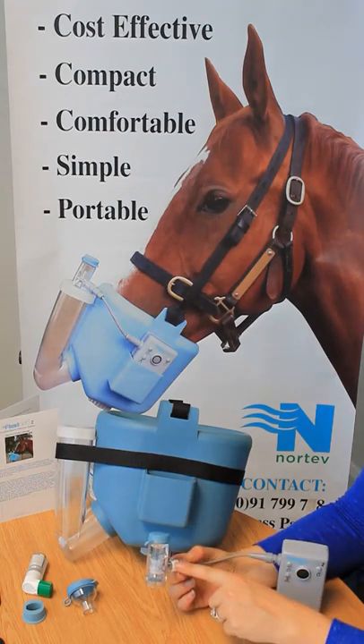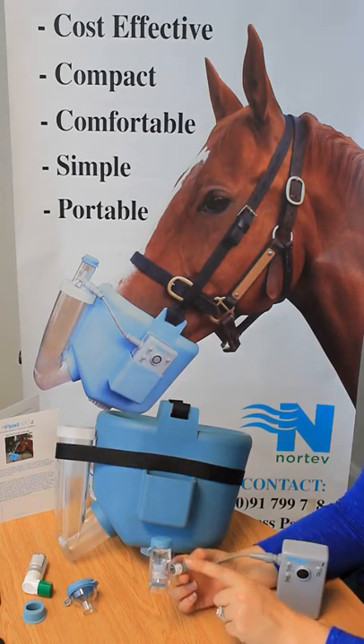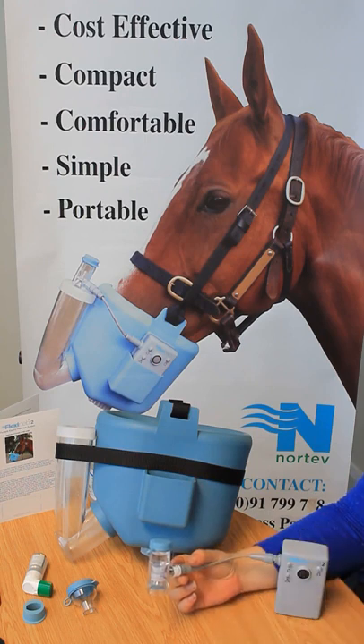Your Flexinib Equine medication cup explained. Flexinib Equine can be used with a multitude of antibiotics, bronchodilators, corticosteroids, mucolytics, and other natural therapies.